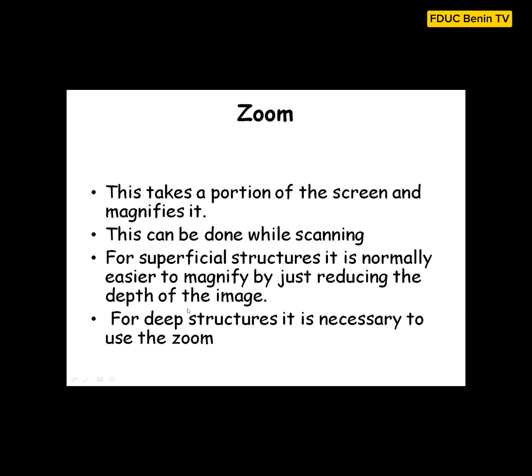If a structure is deep, it's very important that you use the zoom. So as you scan, you find out that you use the zoom and the depth button together to be able to magnify your image and see structures in detail.